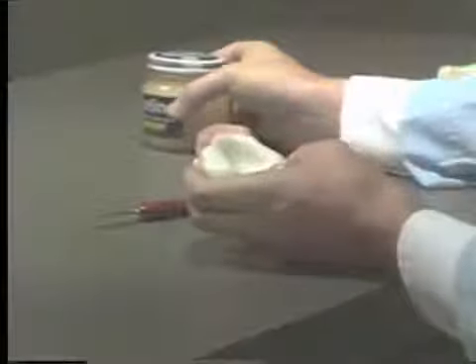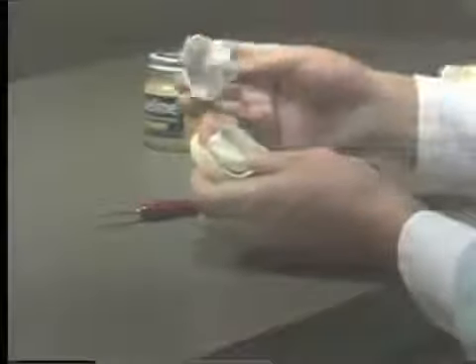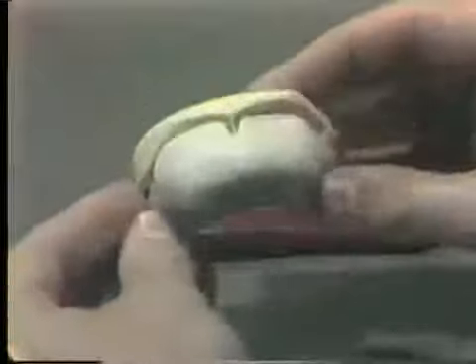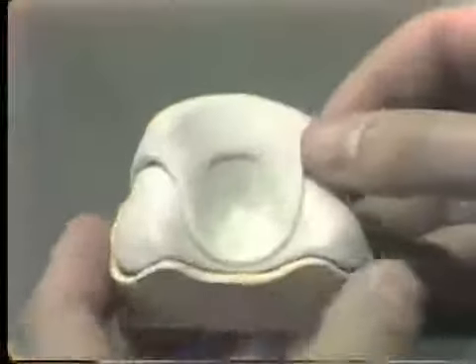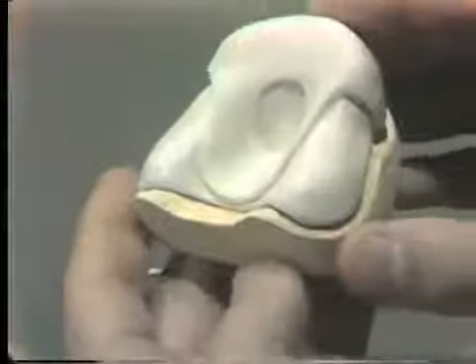A new mixture of Forma-Tray is made, and the second tray is then made so that it extends up into the labial vestibule in the anterior area, over the teeth, and then has a large posterior border which exactly keys onto the first tray.